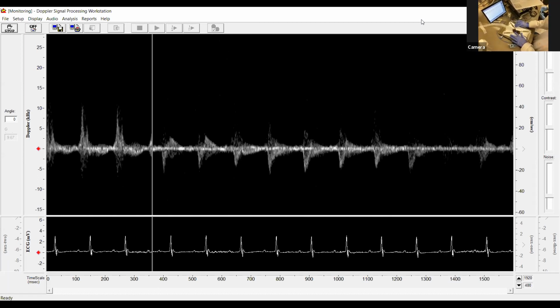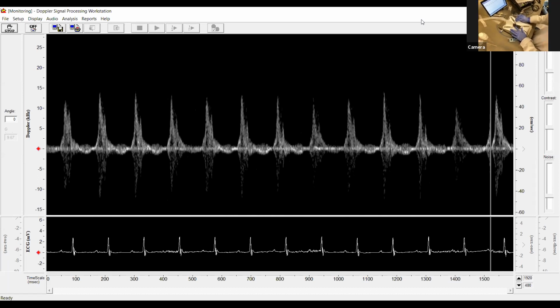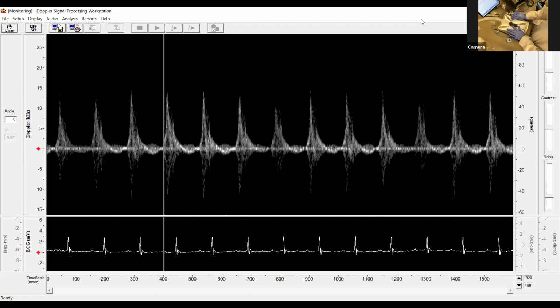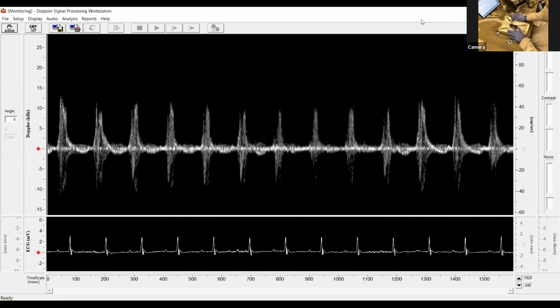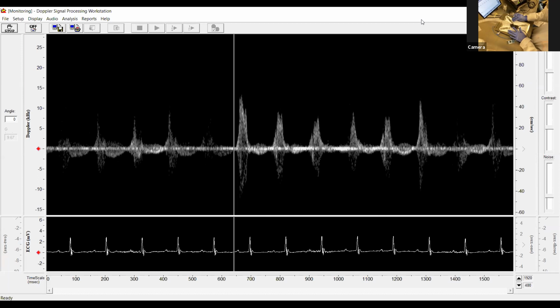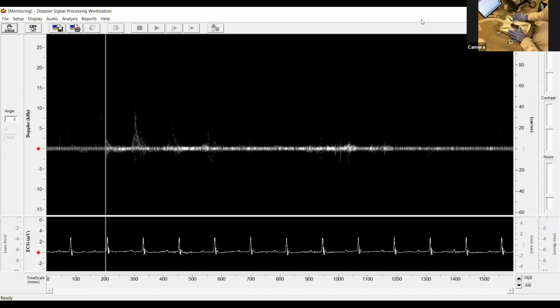And so by placing the probe, the way that Sydney has it oriented is the mitral valve. So here we're actually seeing quite a nice strong signal of the mitral valve, the E and the A peak, as we talked about before. So these hearts are obviously shifted in the chest. Because this would not be the view that we would typically take.